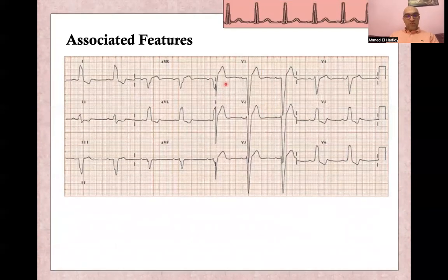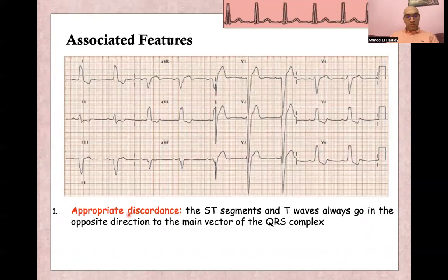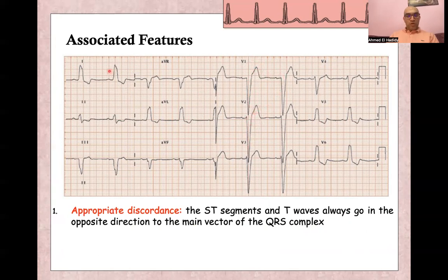There are associated features with left bundle branch block, including appropriate discordance. Appropriate discordance means the ST segment and T wave always go in the opposite direction to the main QRS vector. When the QRS is negative, the ST segment will be elevated and the T wave positive. When the QRS is positive, there will be ST depression and a negative T wave.